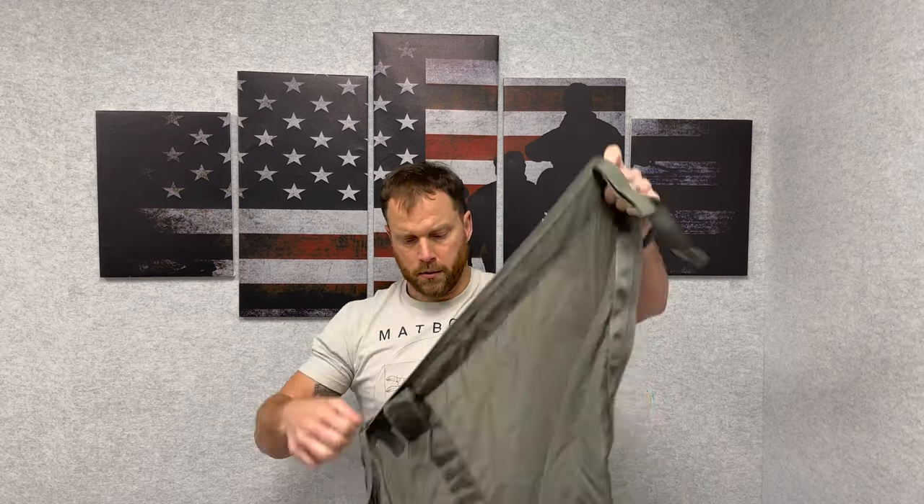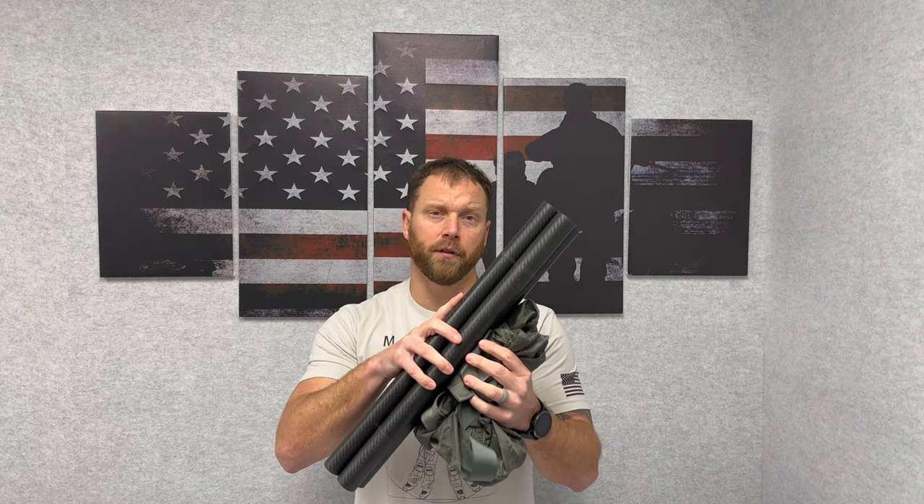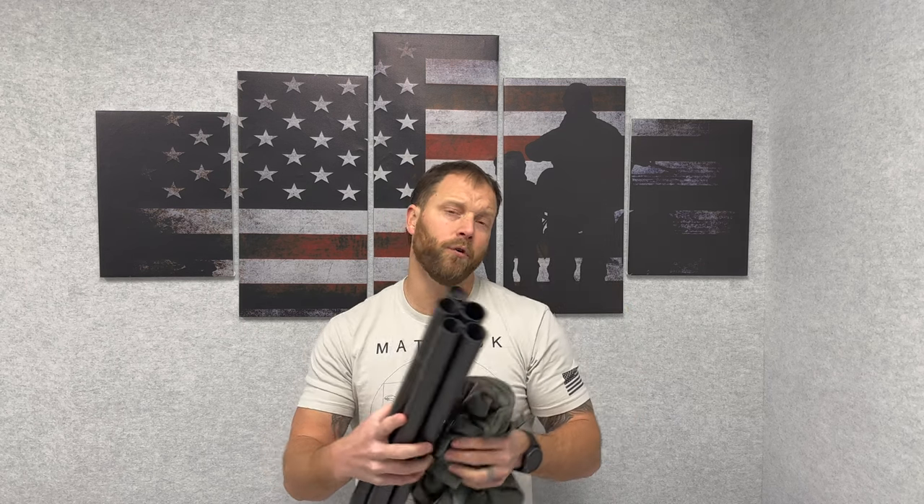If there were a casualty on the battlefield, you can quickly unzip this to now make a six and a half foot stretcher. Our combat carbon poles are the backbone of the lift system. These poles go right into this S-Lift to now make a six and a half foot semi-rigid stretcher that only weighs three and a half pounds and will carry 400 pounds.